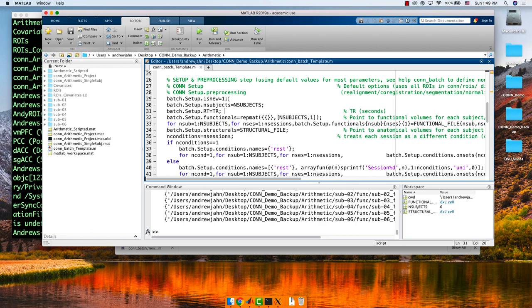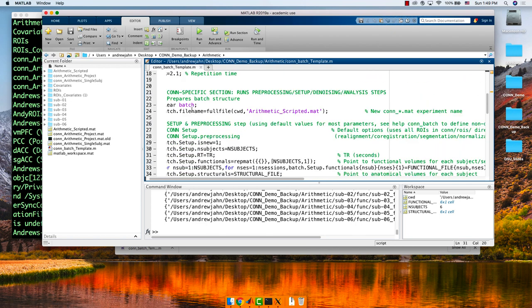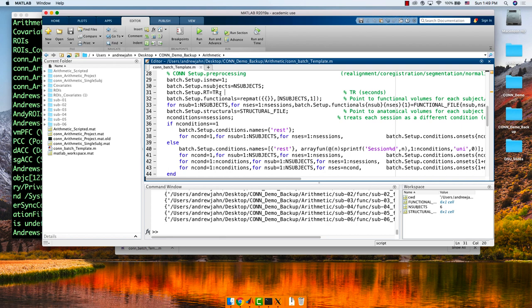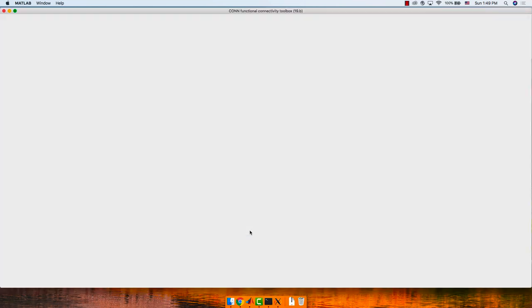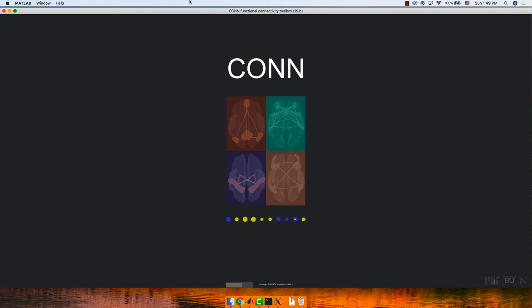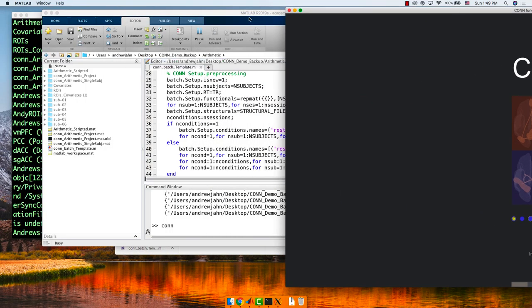To convert some of these to plain English: batch.setup.isnew equals 1 — I'm indicating this is a new project, not overwriting something that already exists. N_subjects is going to take on the variable listed up here, in other words six. The TR — let me open up the CONN GUI to show you the correspondence between all these things so you can make educated guesses in the future.